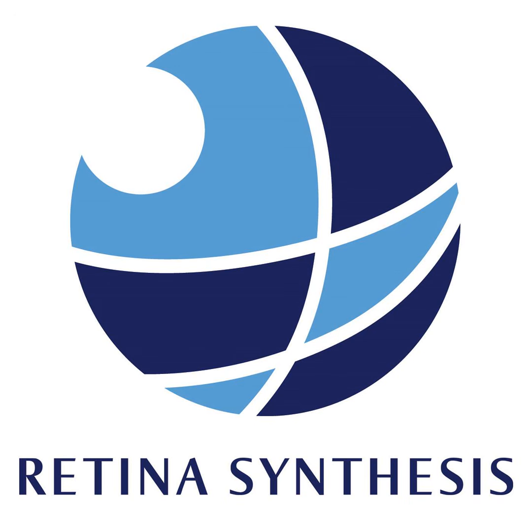Well, I think the next step is validation that the scans are equivalent to what we have in our office. It's part of getting the FDA to approve it. It's part of getting physicians to accept it. And so the study that is currently ongoing involves multiple centers, a total of 128 patients. They're on the machines for 5 weeks. And during that 5-week period, they take the scan at home, but then they come in the office the same day. And at least in my study center, they're getting a Zeiss Cirrus scan. And the quality of the scans, the information from the scans taken on the same day between the two devices, is being compared. So it's really validating the machine and making sure that it's accurate and reliable.